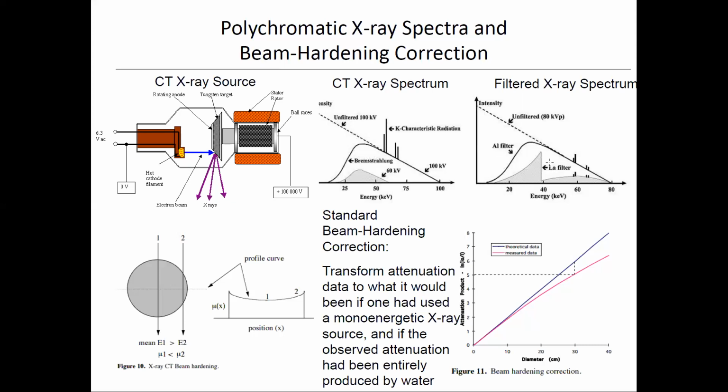And you can also introduce additional materials into the beam line to do dual energy that way, which is actually what we did with our security machine. That's less used for the medical, but okay, there's a bunch of ways to get energy information if you're being sort of crude about it, not trying to do it event by event, and you might not necessarily have the highest contrast between different energies. There's lots of ways to do dual energy. But most machines don't do it at all. They just treat everything as if you had an average energy for every X-ray.